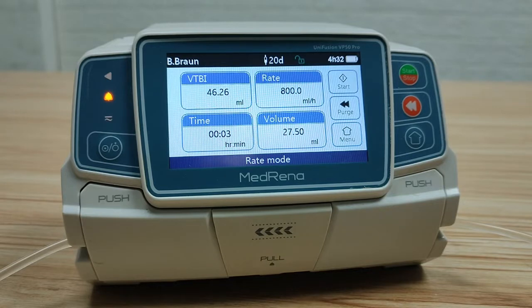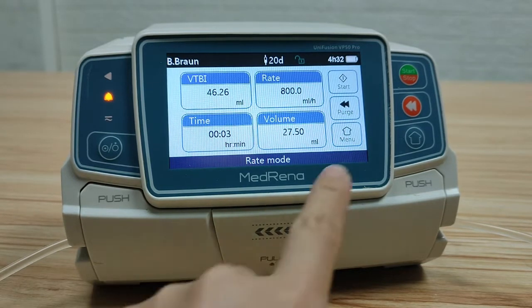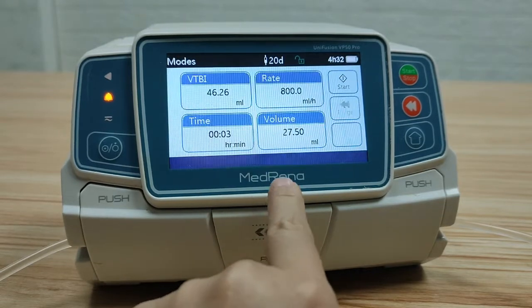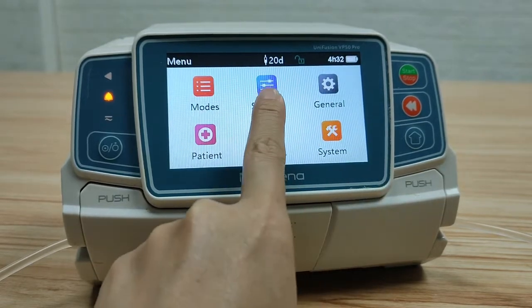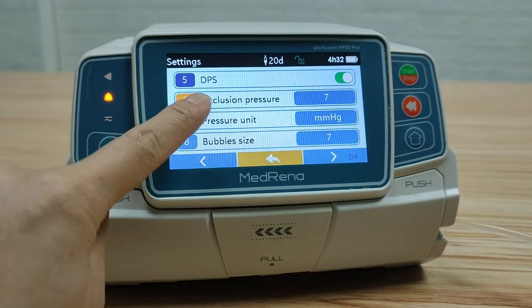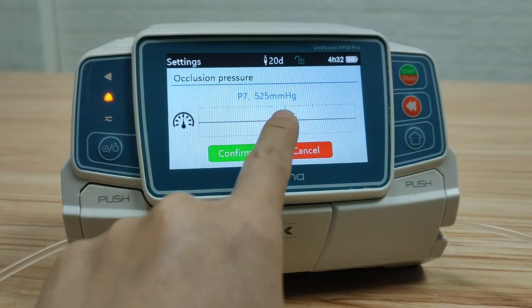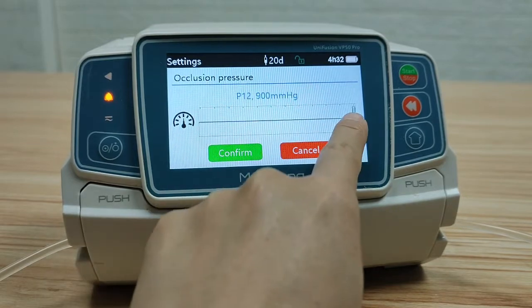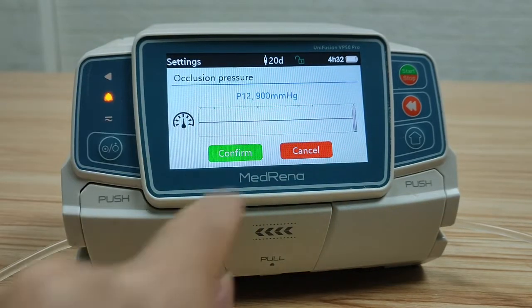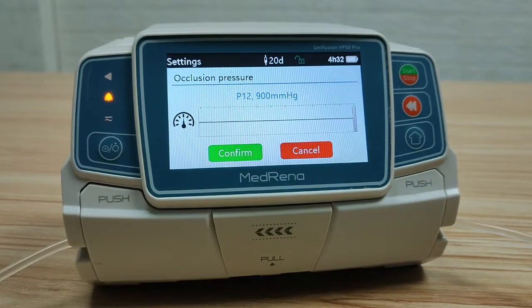The DPS function is only available in advanced models; it is not available in standard models. Next, occlusion pressure. This model has 12 occlusion pressure levels, ranging from 75 to 900 mmHg.